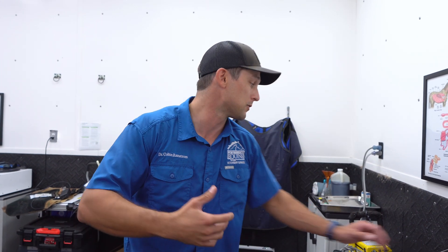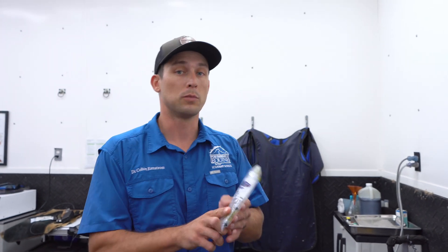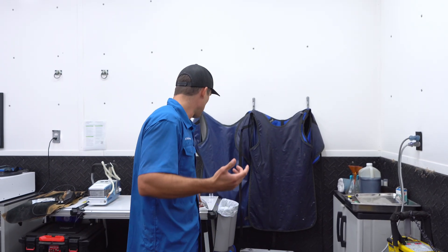This mare we're working on right now — we pulled alpha-2 macroglobulin on her last July, so we're about 11 months out now in June. One of the nice things about that product is we can pull it and get a pretty decent volume, anywhere from 30 to 35 CCs per kit. We inject whatever we need on that horse, keep what's left over in the freezer. We pulled some out of the freezer today — still sterile — defrosted it. She's been doing great for the last 10-11 months, starting to get sore again. We did an evaluation, determined where she's sore — pretty similar to where she was last year — so we'll treat her, get her feeling good again, and keep on moving.